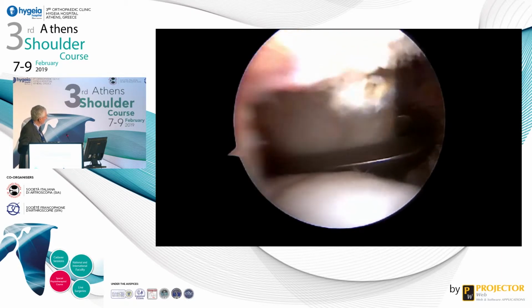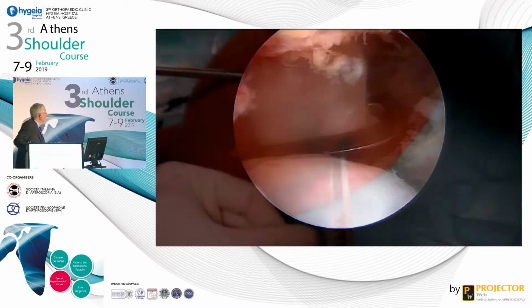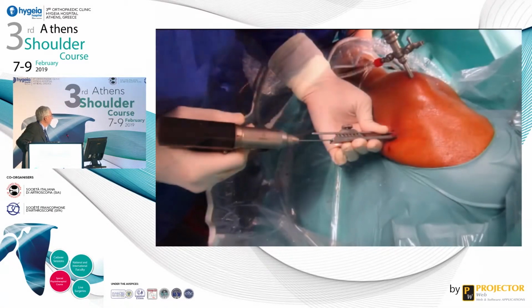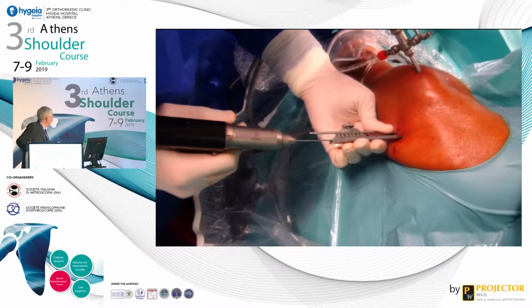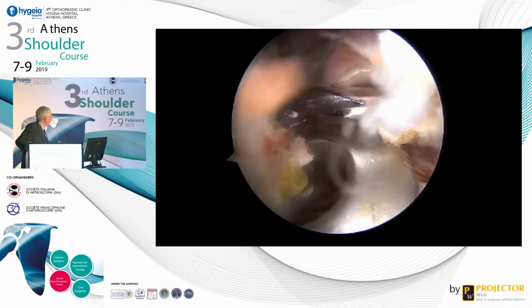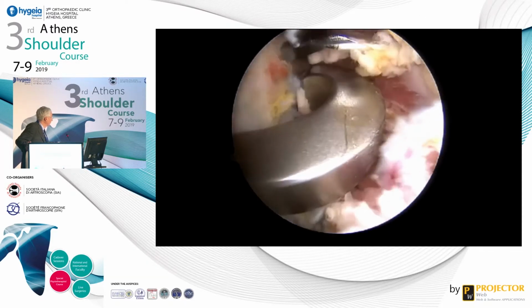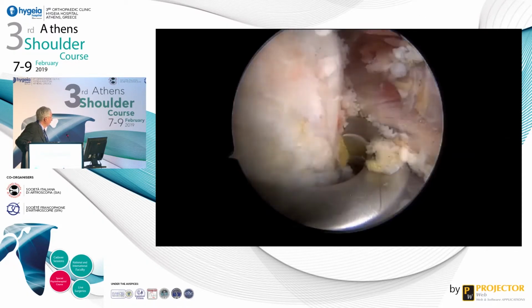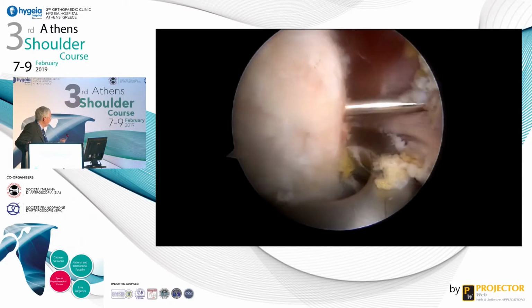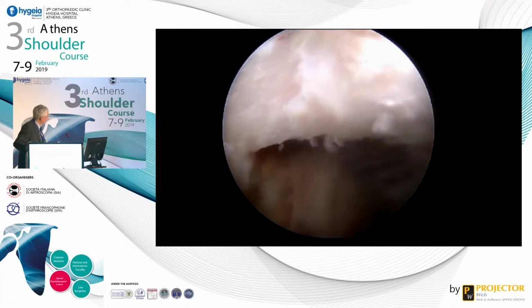Here you see the positioning of the hook of the jig. You connect the second part of the jig to the hook, and you drill. You drill the anterior one first. You can check you have enough bone under the hook, and you pull the drill out, and just after, K-wires.